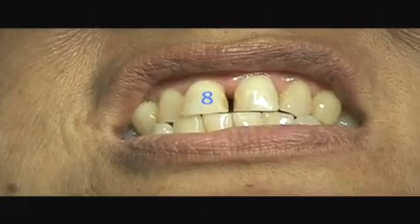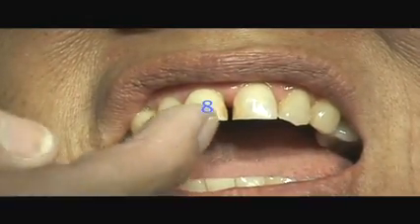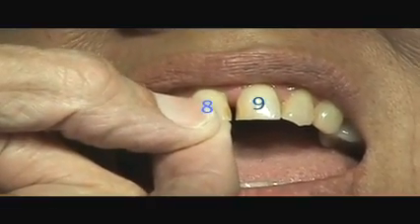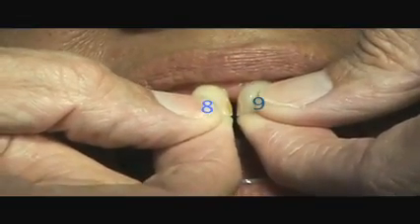Tooth number 8 has slight mobility. It is sticking out to the labial and has an open contact with number 9. Tooth number 8 will be extracted and replaced with the immediate Carlson Bridge.